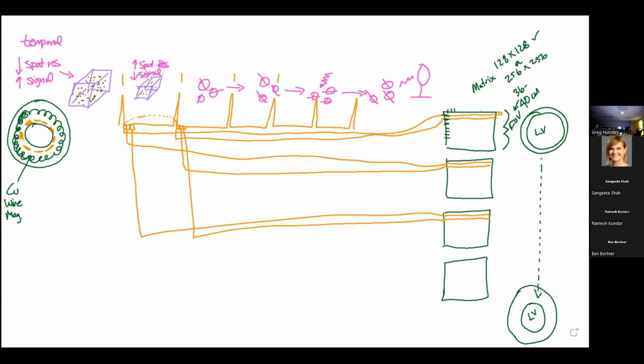So you're going to hear terms like gradient strength. Let's go back to our orange. When you go to the Virginia Techs or the VCUs, or anybody you want to pick, they tend to get scanners with a little bit more oomph, not just 3 Tesla versus 1.5 Tesla, but more than what you would get at a community hospital in a rural area of one of our states.